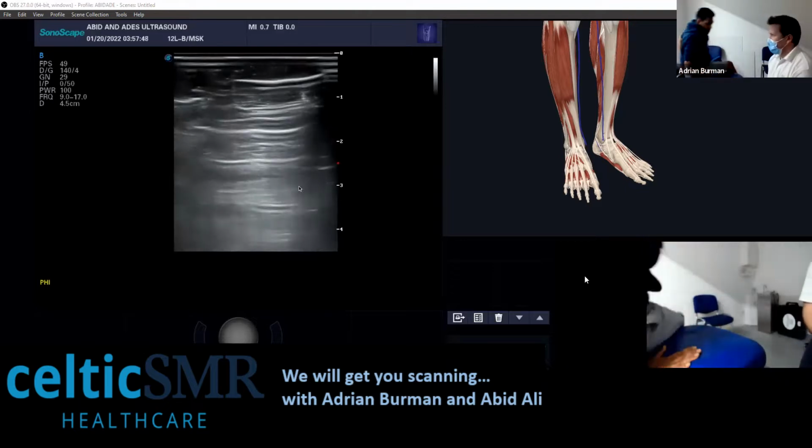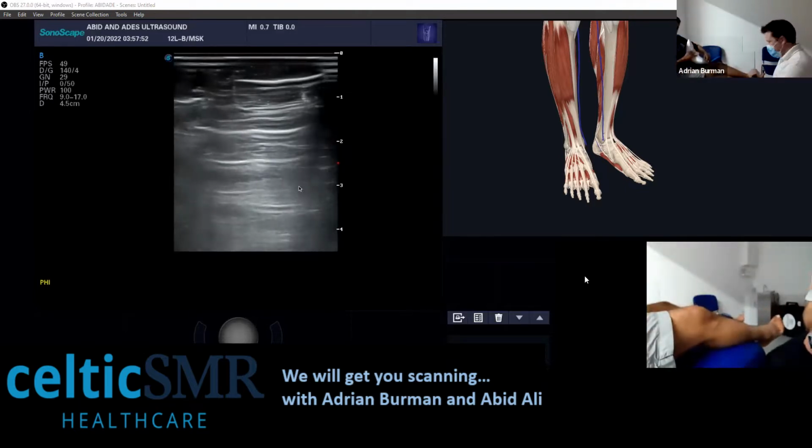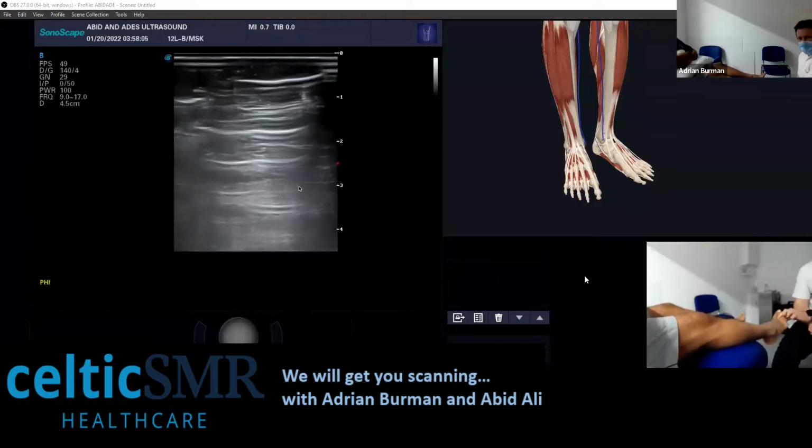So, there are some people that look for neuromas dorsally. I don't tend to, but you can look dorsally. And if you've got a hockey stick probe, then dorsally is quite good, because you can get in between the toes and interrogate them a lot easier than you can with a wider probe. So if I've only got this, then I tend to look plantarly.